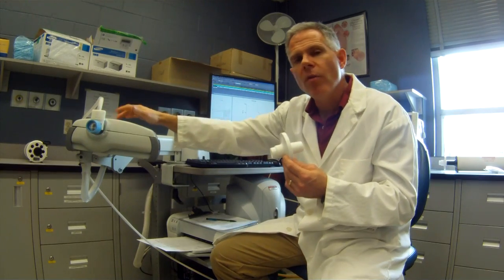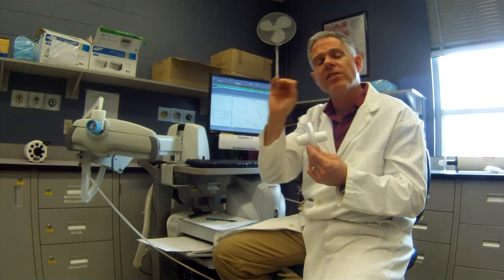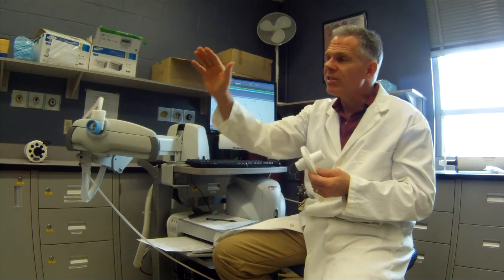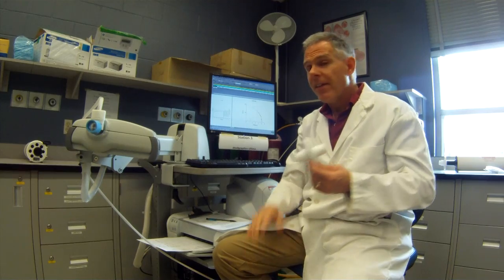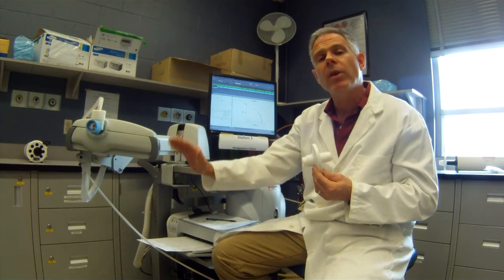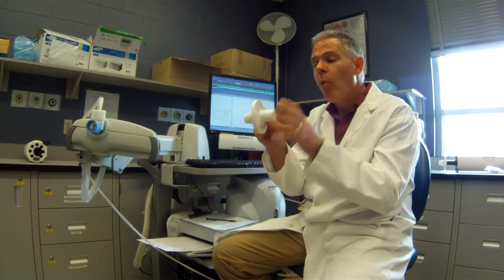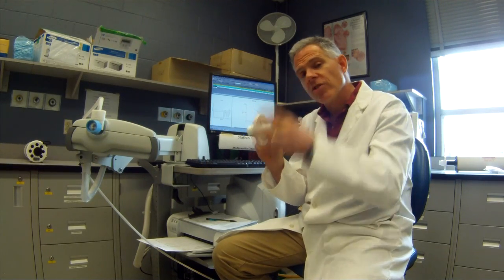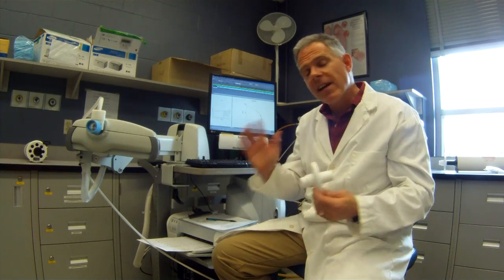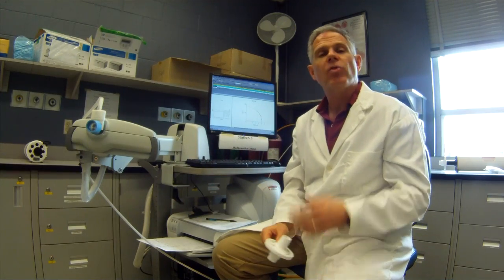And then when we click them over so that they're breathing this unusual gas, we want them to keep breathing at the same rate and tidal volume. So just nice, easy breaths. They don't have to change anything throughout the whole test. Just nice, easy, even breathing, keeping a good seal with their lips tight around the mouthpiece so that there's no leaks for about 7 to 8 minutes. And we'll watch them on the screen, and then when the test is done, we can tell them to relax.